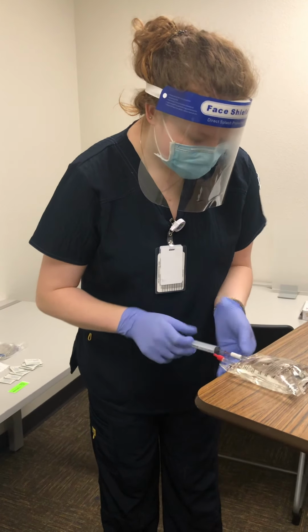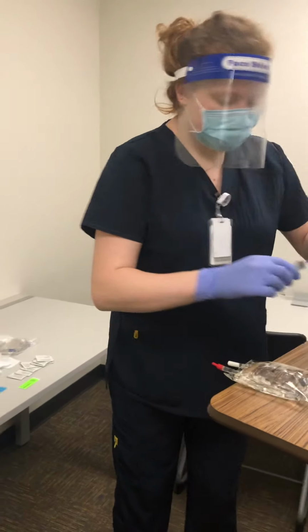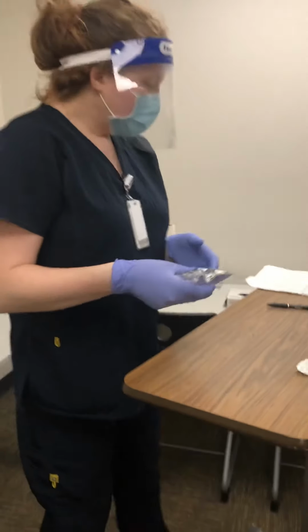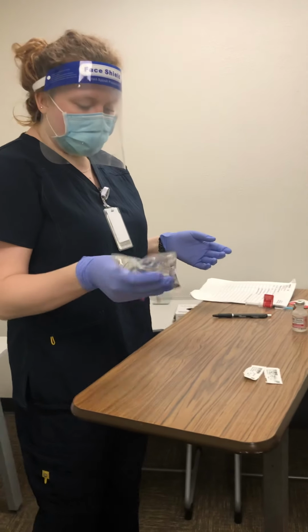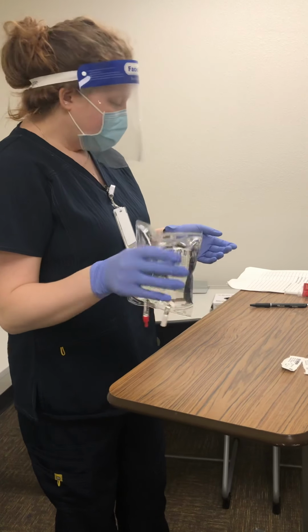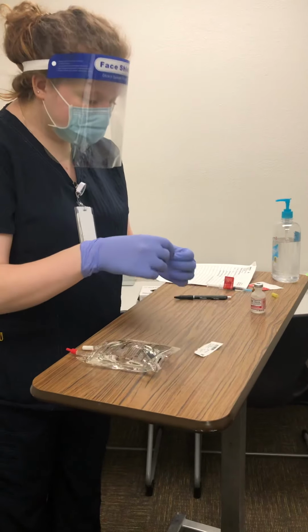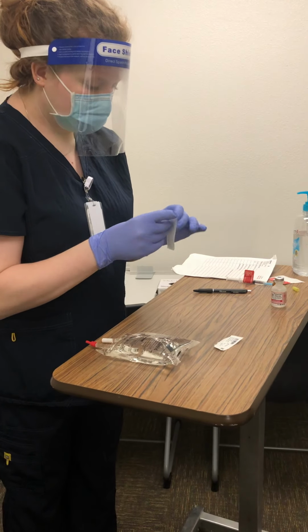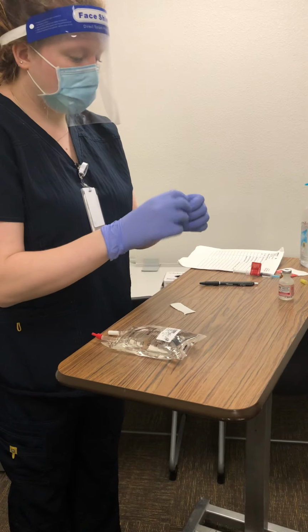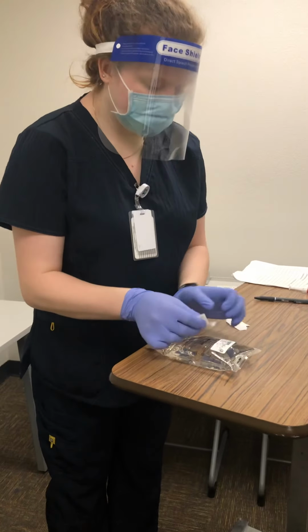Okay, perfect. This comes out here, and the needle goes in the sharps. Now we're going to gently mix it until all the medication is mixed together. Okay, back and forth. And I'm going to label it with our potassium medication label, and we're going to label it with one of the patient's identification labels with their information on it.